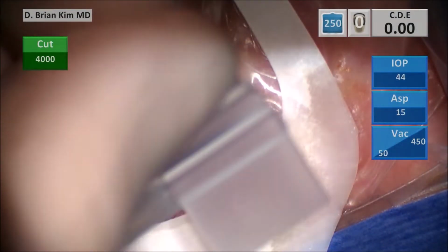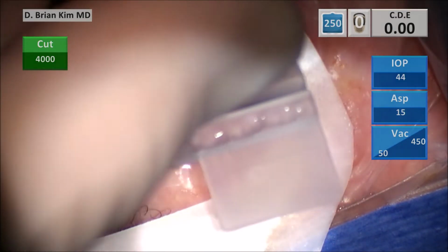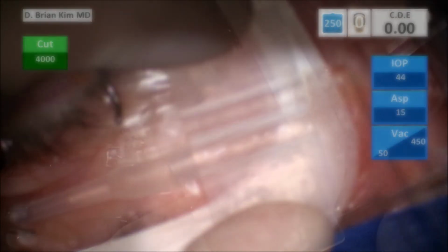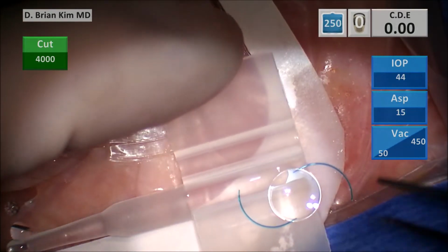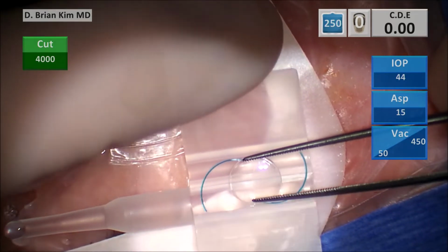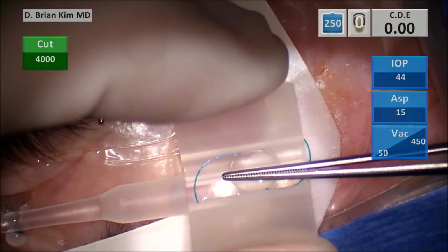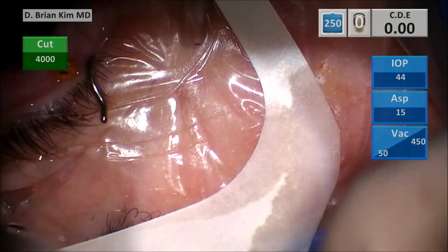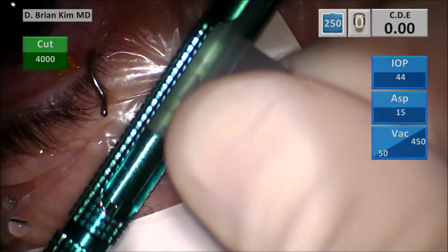This is some cohesive viscoelastic filling the chamber of the cartridge. This is the sensor lens. I was just barely holding it. It just kind of fell, but that's fine. I'm going to turn it over, making sure it's seated deep in the cartridge, making sure that the leading haptic comes out straight, making sure the optic is concave, making sure the trailing haptic comes out of the cartridge, sticking out just like that. Bring the wings together, placing it within the injector now, pushing it all the way through.